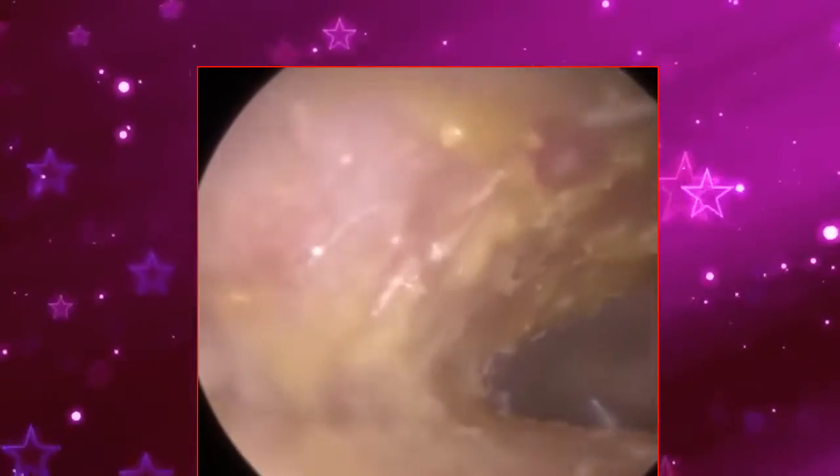Now, we don't have a tripod, so when I'm examining the ear, when I'm doing the procedure, the endoscope, the iClearScope device, is being held in my left hand and the instruments are being held in my right hand. And they're both suspended. We don't have, as I said, a tripod to keep things steady in that respect. The patient's also awake, so they can also be moving. So it's really, really tricky. And you'll see we do manage to get a lot of this out.